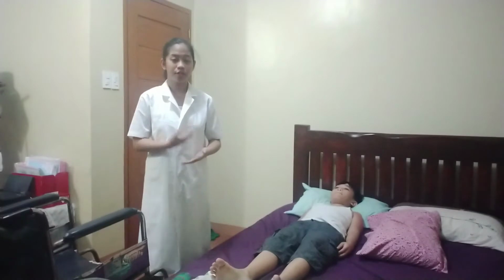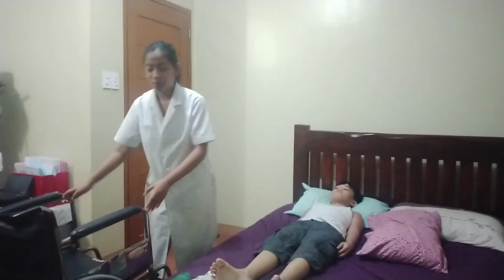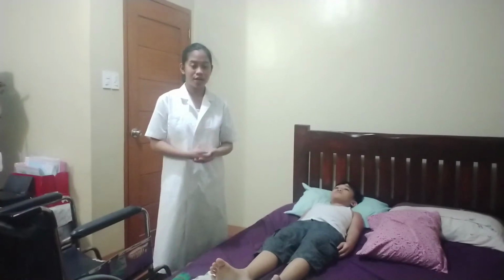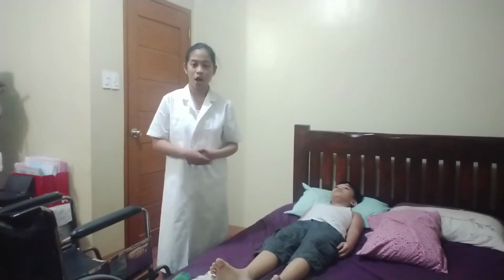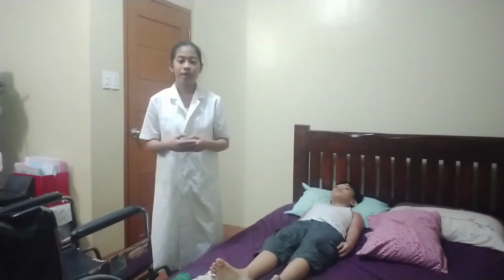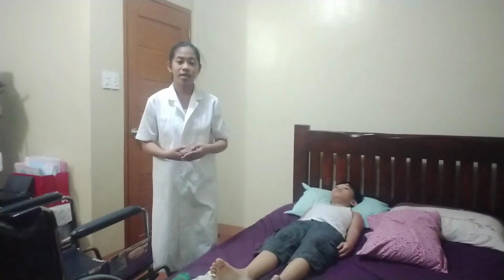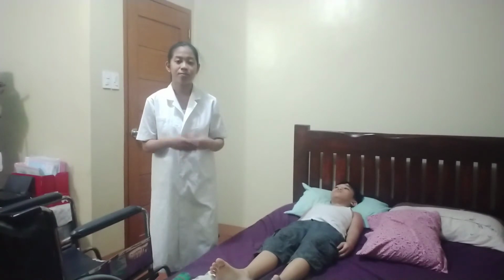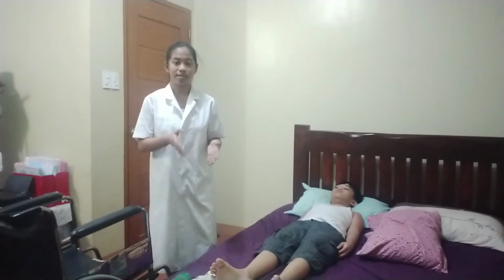And then after that, I will now encourage the use of a stand assist device by my patient if it is available or necessary, either freestanding or attached on the side of the bed, to help the patient to move on the side, in the side lying position facing the side of the bed in which the patient will sit.